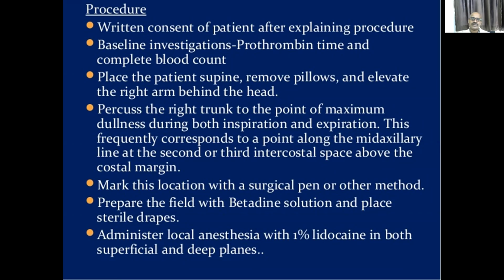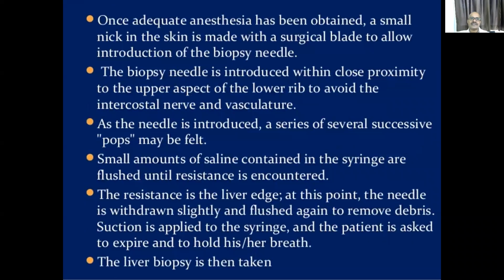Prepare the field with betadine solution. Place sterile wraps. Administer 1% xylocaine in the superficial and the deep layers. So once adequate anesthesia is applied, a small nick is given on the skin with a surgical blade to allow the introduction of the biopsy needle.